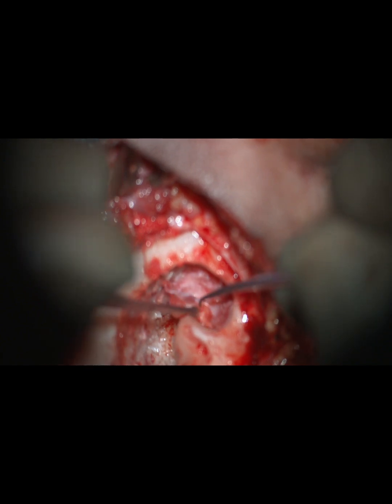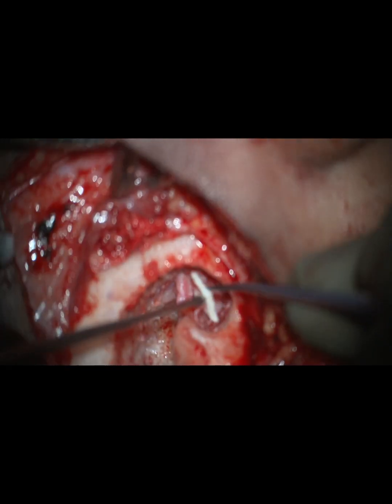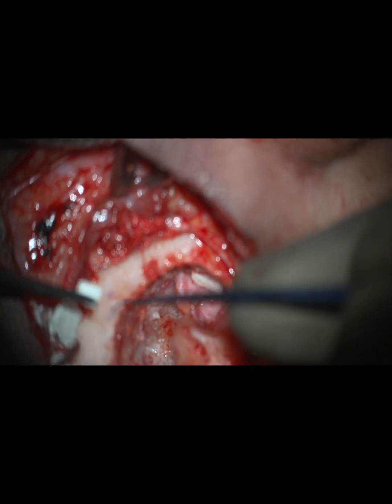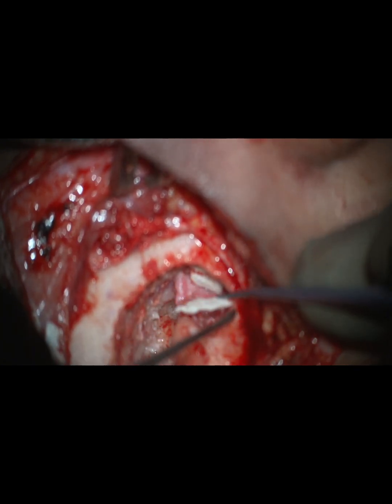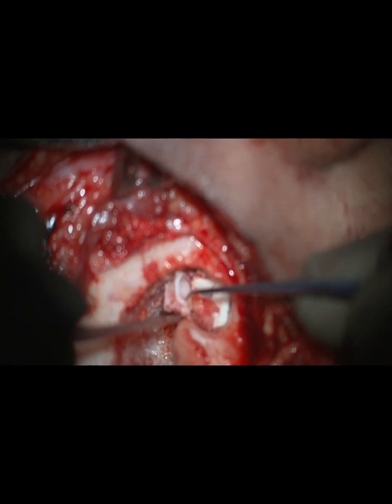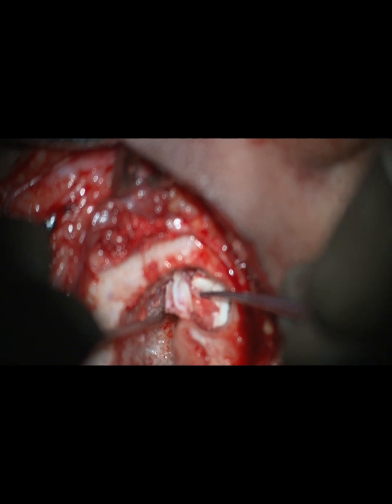Then a split thickness skin graft of 0.3 millimeter was harvested from the right thigh using a Humby knife and was placed all around the canal. Pieces of dry gel foam are being placed to avoid any displacement of the graft, which will be removed before we place the split thickness skin graft. The cartilage from the tragus is being used for reconstruction of the posterior canal wall.